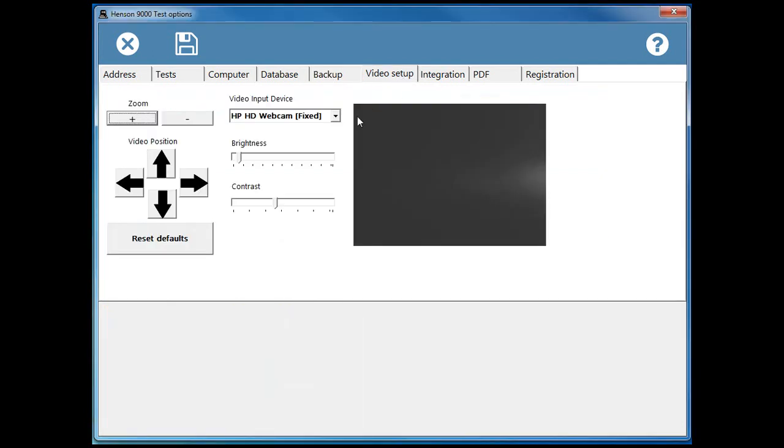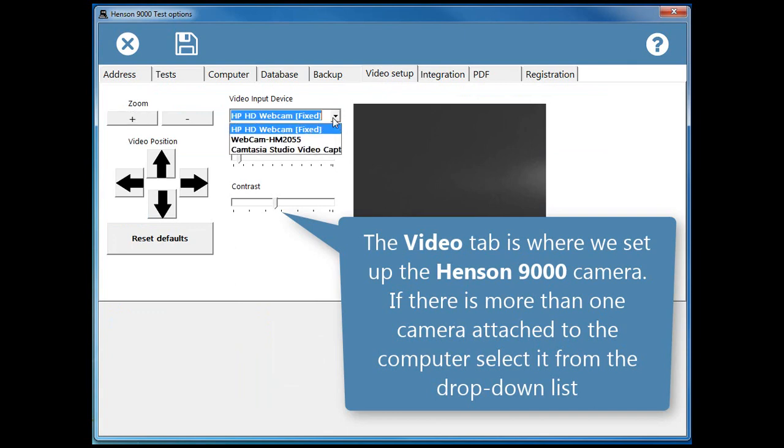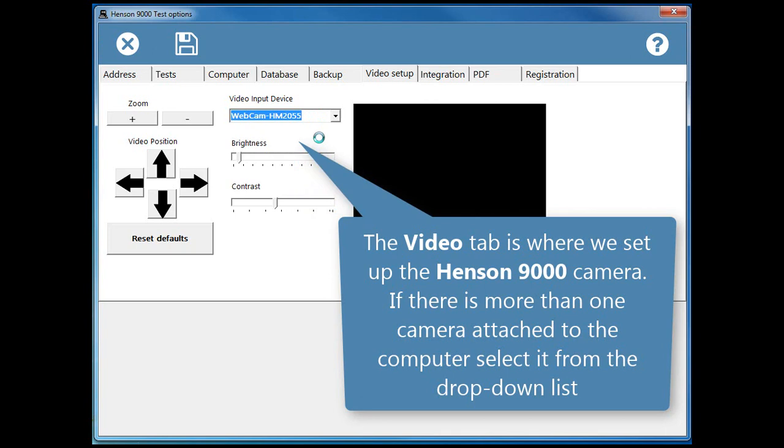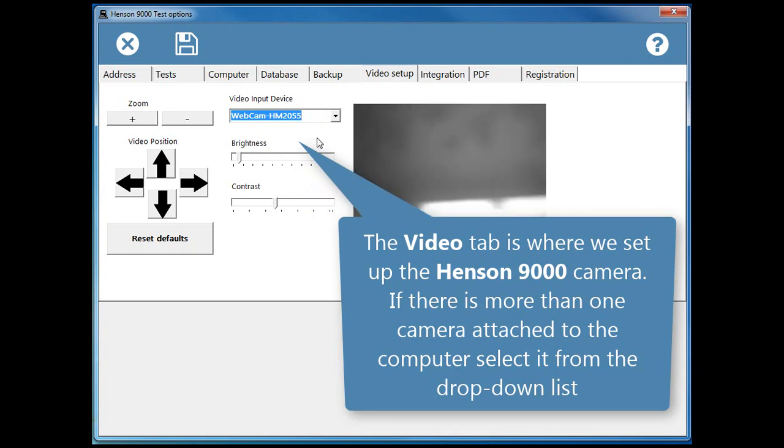The video tab is where we set up the Henson 9000 camera. If there is more than one camera attached to the computer, select it from the drop down list.